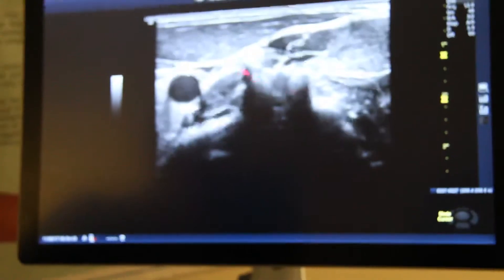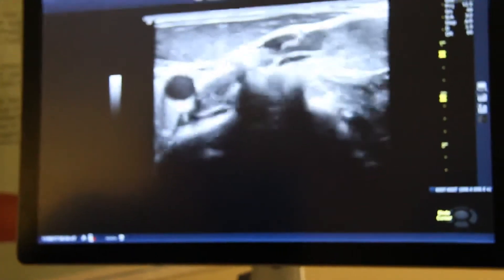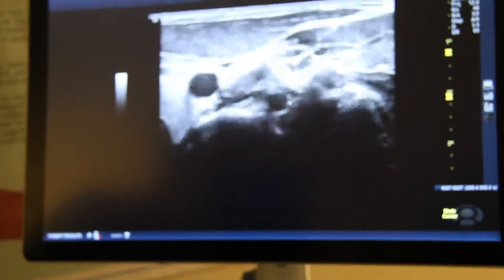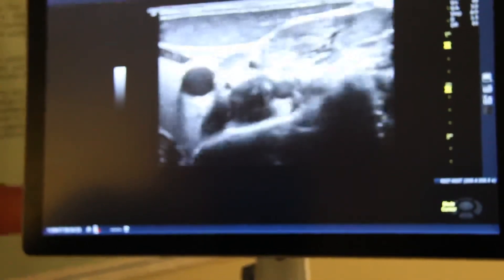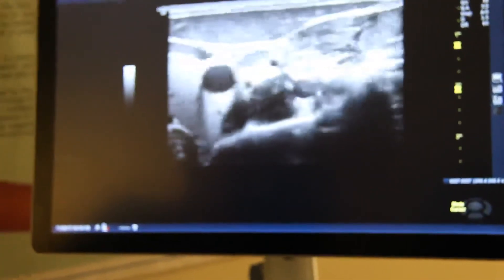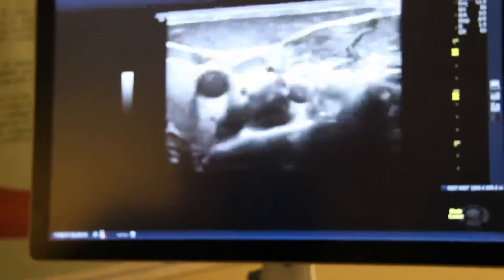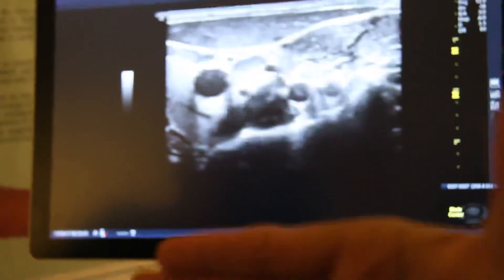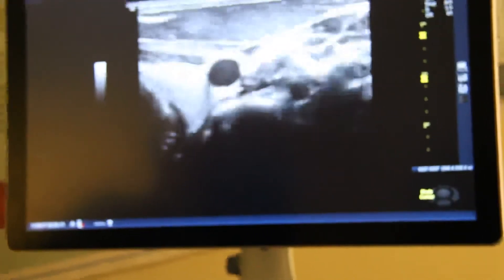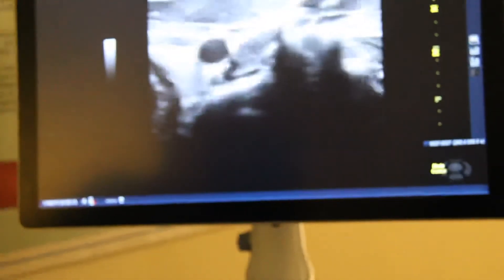It looks like a ghost where you have a head and you have both hands. Every time you see this picture, you're either at C5 or C6 level. But you need to confirm that by going down to see there is no more anterior tubercle — only a posterior tubercle — and that's your C7 level. I always call this the lounge chair position, where you have your thumb and you have your vertebral artery along with your vertebral nerve root.